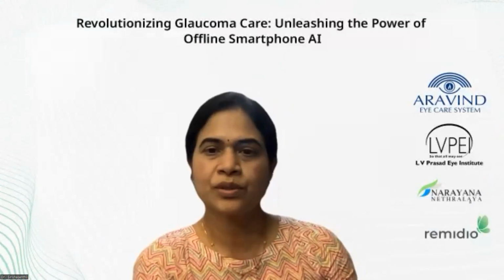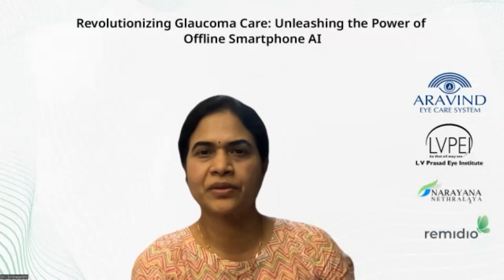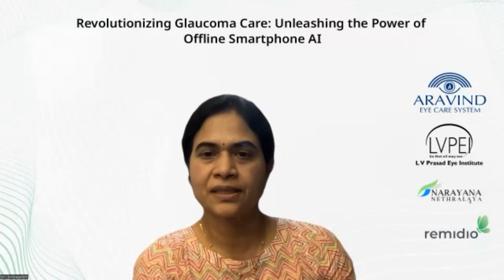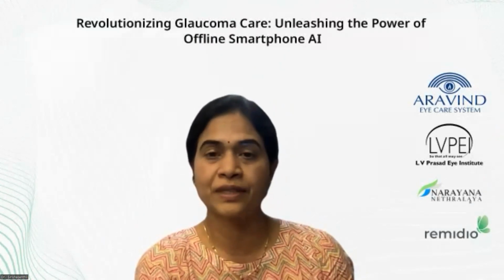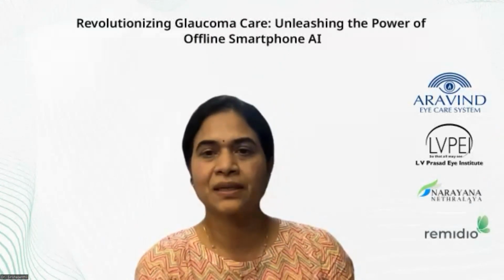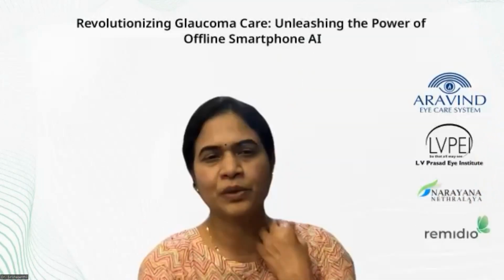Yeah, so anybody who's trained to take a fundus photograph can use it. It's nothing in particular, whether it's an optometrist or a technician or a nursing assistant, whoever it is. They need to understand, like whatever Dr. Divya just said, whether there is any media opacity, can this be performed or not, is there significant cataract? For that, the optometrist's role is there to say whether it can be done or not. But apart from that, I don't think optometrists in particular need to be trained in doing the testing. Any technician can take a simple photo. The role of optometrist or ophthalmologist is, can this be done? Is it needed? That is where they can help.